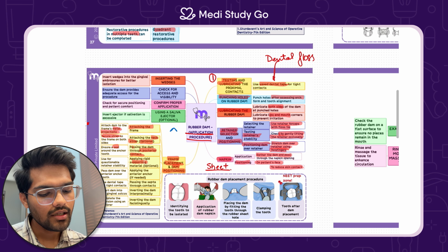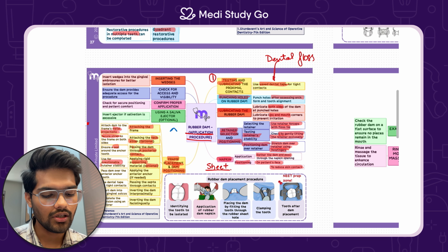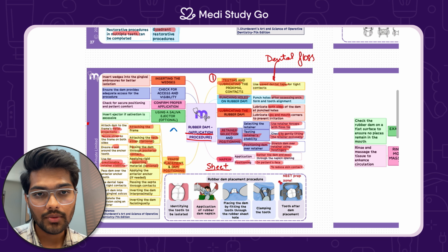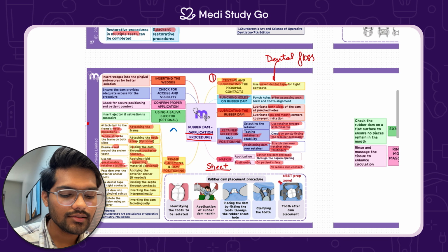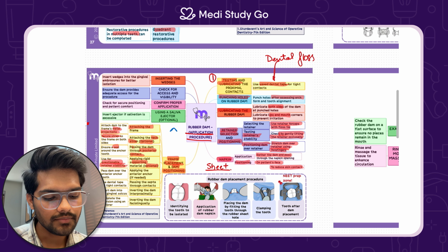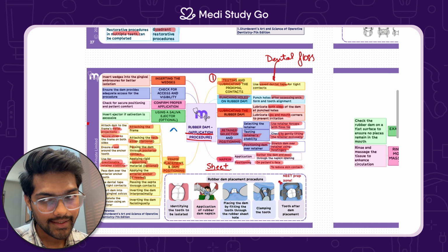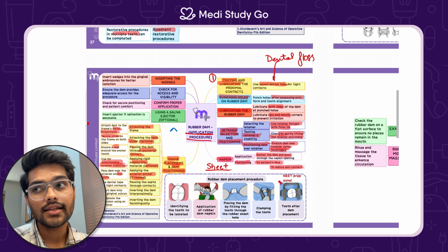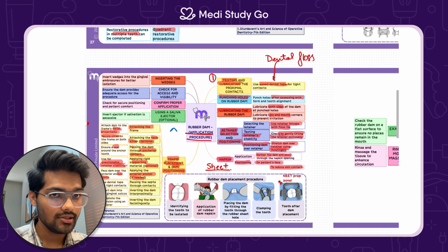Applying rigid supporting material. This is another optional step in case the retainer is not very stable on the tooth because it's not fully erupted or any such things, then you might want to consider adding a supporting rigid material. Next, we have to apply the anterior anchor tooth, or just apply the retainer on the anterior tooth if you're doing multi-tooth isolation with rubber dam.